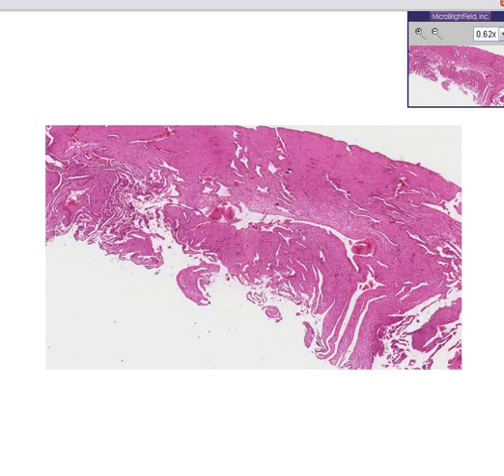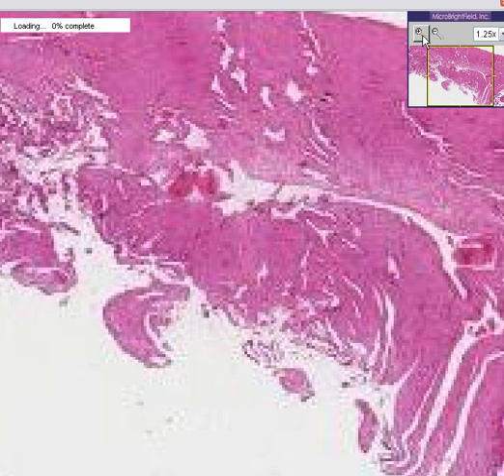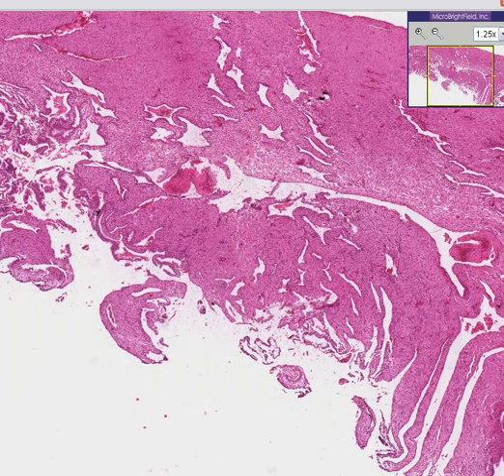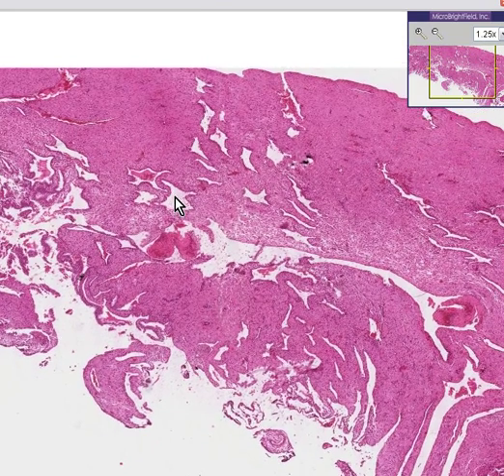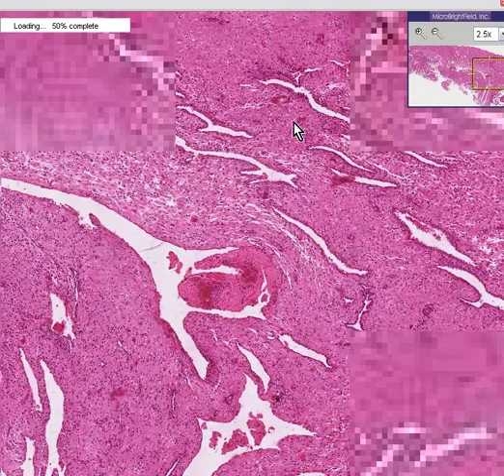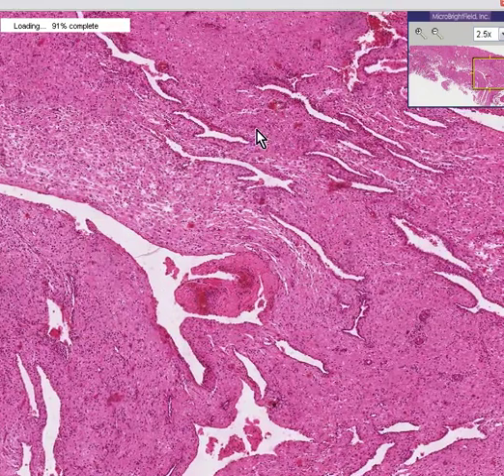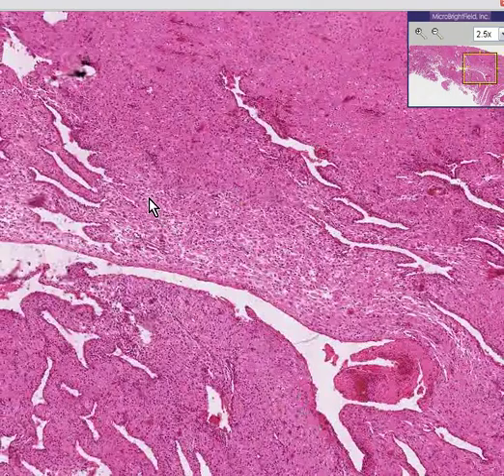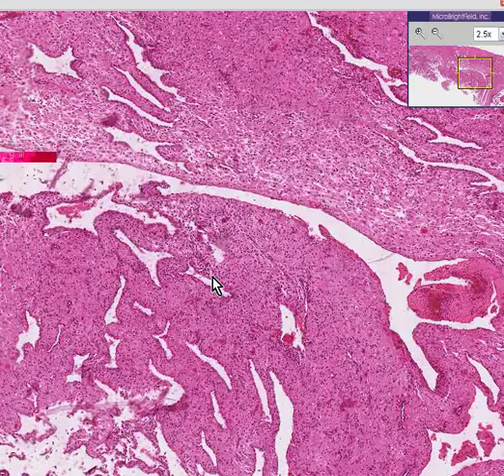This slide is called uterus decidual reaction. And even though it's called uterus and the uterus is mostly myometrium, you really can't see any smooth muscle on this slide at all. It's all endometrium. So, let's describe this endometrium.